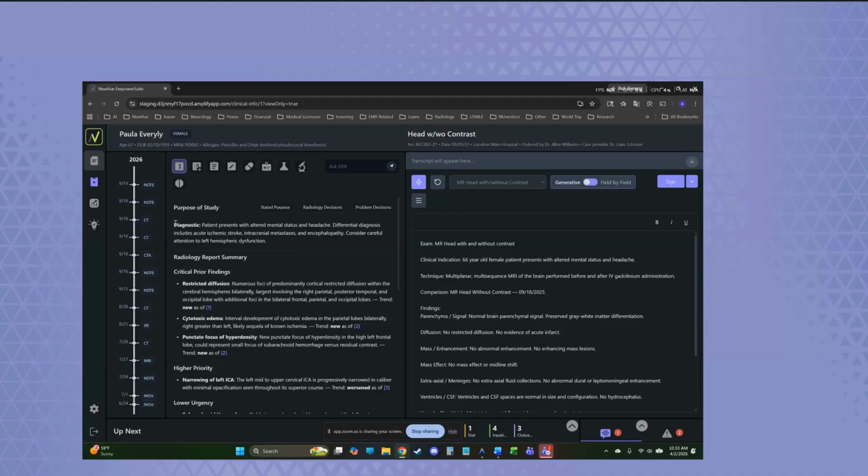Most or a lot of radiology studies are done for diagnostic purposes, as this one is, meaning that you're trying to figure out some clinical presentation for the patient. They're having symptoms or whatever, you want an answer. But not all studies are done for that. You might have a study that's just scheduled screening for some problem. You might have preoperative guidance study. You might have a post-operative follow-up or hardware evaluation. You might have a trauma study. But for diagnostic purposes, we'll give you what's the current clinical presentation, what differential diagnosis people are working with, and for head imaging, we'll even give you a tentative localization if that applies.